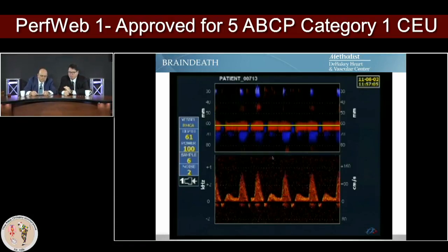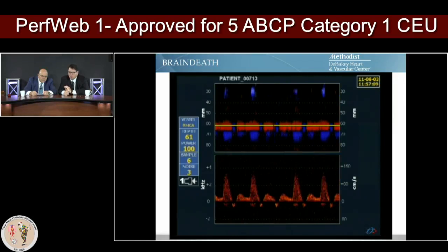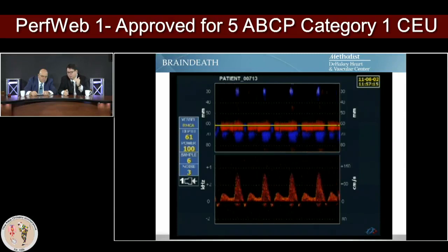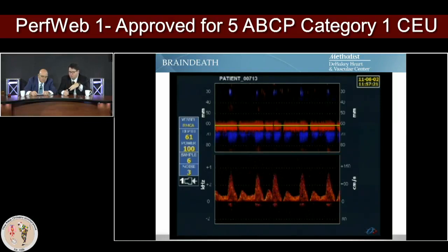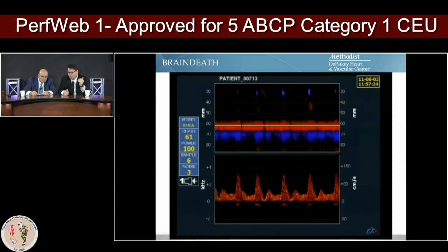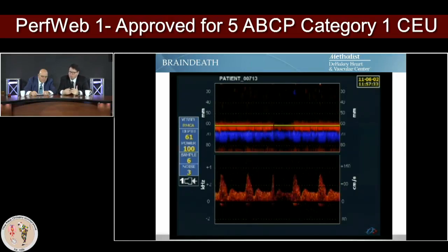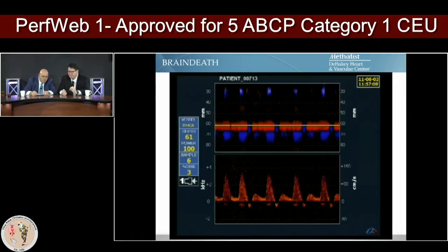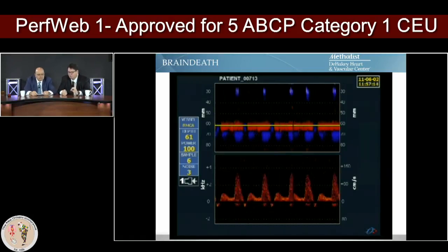So right now from 30, we're going to increase the pressure to 80. So watch that blue flow gap between those red signals. We're going from hypoperfusion, and we assume this person is brain dead, and it's not brain dead, we're just not perfusing the brain. So suddenly when we start to perfuse the brain and we raise the pressure from 30 to 80 mean arterial pressure, we have a gorgeous flow to the brain. That's why we call the TCD almost like a stethoscope to the brain, that you can really see and listen to what blood flow we deliver. So that's where the perfusion is really crucial.